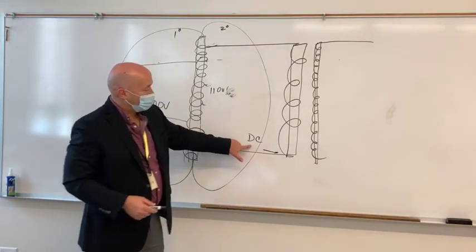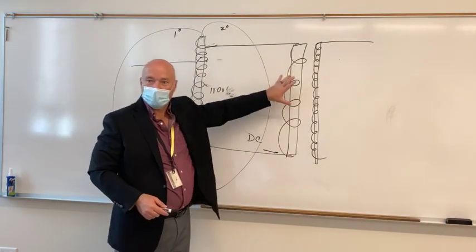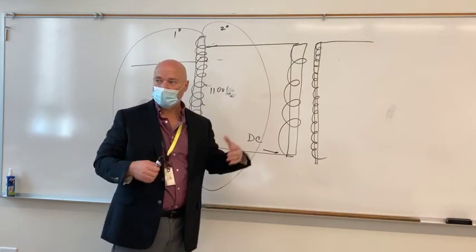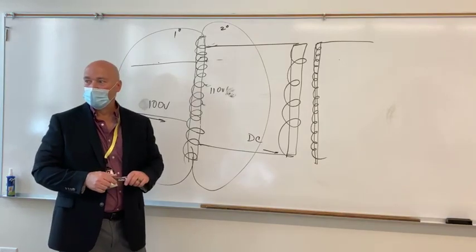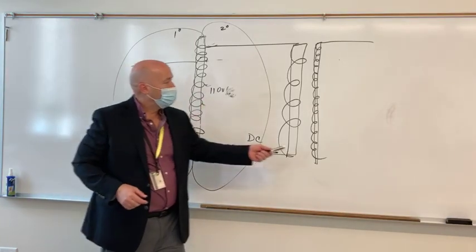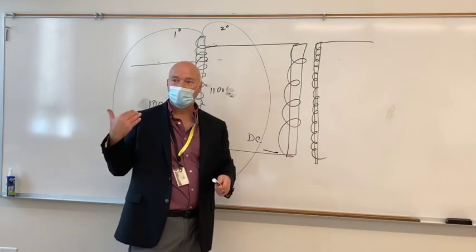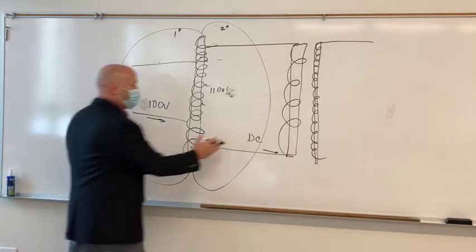So with this direct current, we create a magnet, but does that magnetic field change with the direct current just going through it at a consistent rate? No, it does not. So with direct current, do I get anything over here? No, I don't.